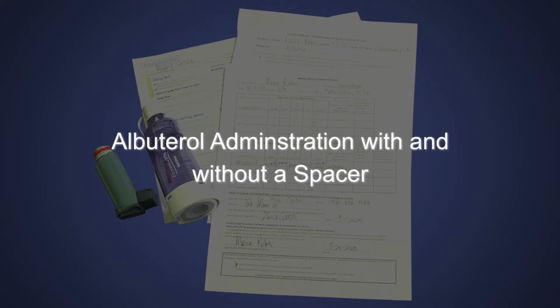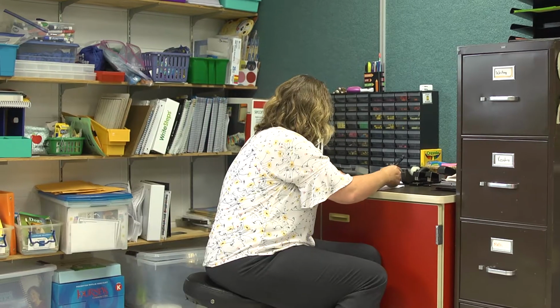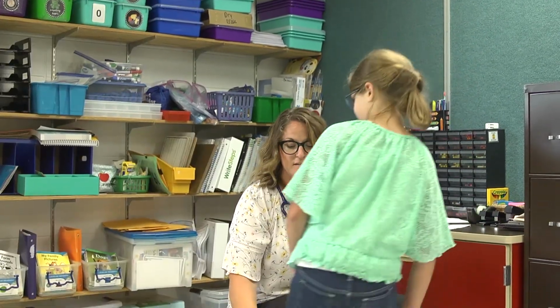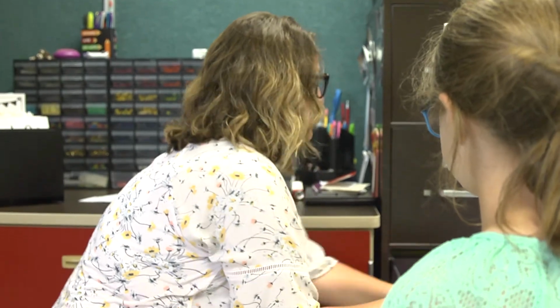Albuterol administration with and without a spacer. Attempt to provide the student with as much privacy as possible given the urgency of the situation. Instructions for inhaler administration with and without spacer. Gather needed supplies and place on a clean surface.